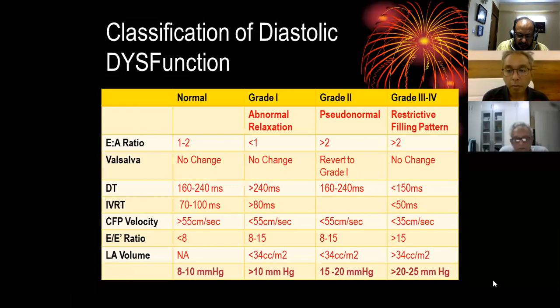Sir, in case of a patient who has LVF, there will be evidence of a dilated LA. LA volume will be more in that case compared to a pulmonary cause or any other cause on the right ventricular side. So the right ventricular changes would be predominant in a right ventricular failure, but if there is a change on the left ventricular side also, with evidence of left ventricular hypertrophy, then it is right ventricular failure because of the left side. All right. Everybody's clear about all this?